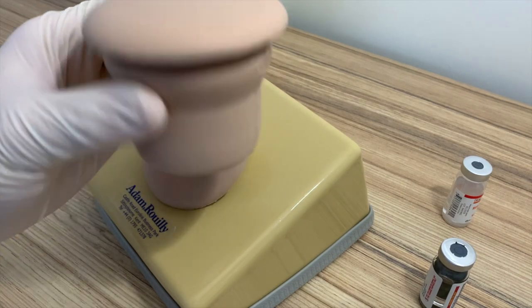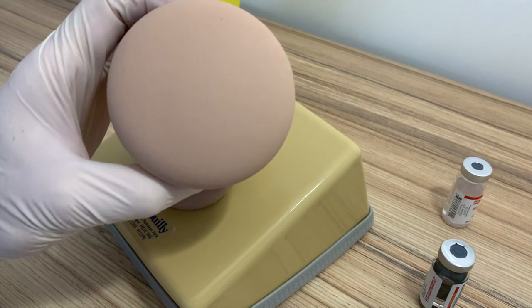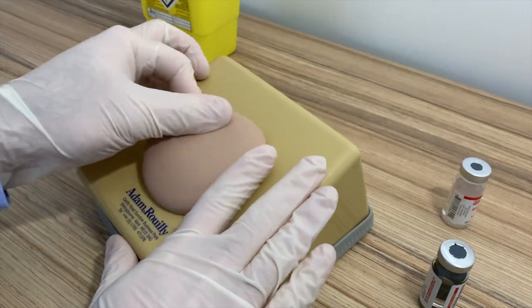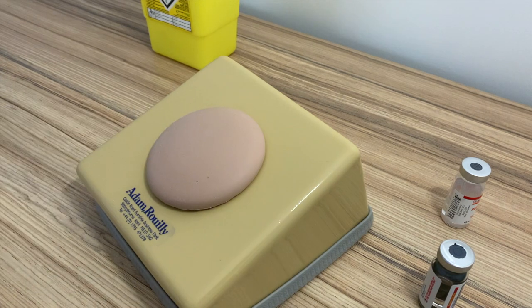The pad itself is a consumable part and will need eventual replacement as spare part code AR37. This simply just fits into the desk stand.